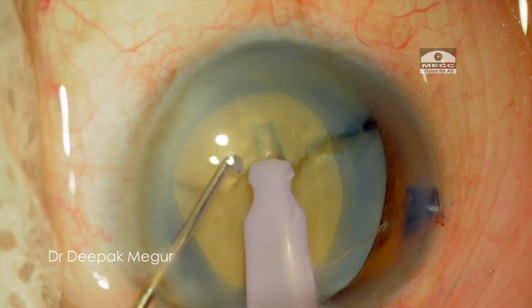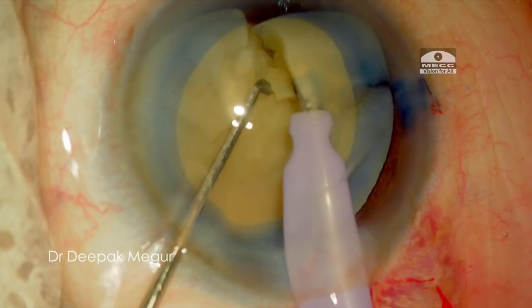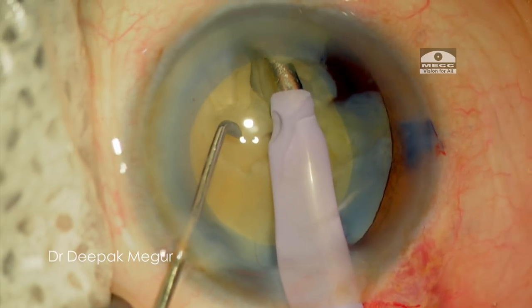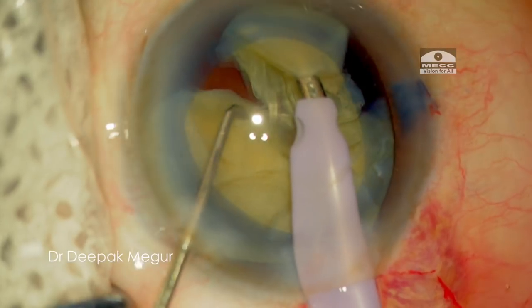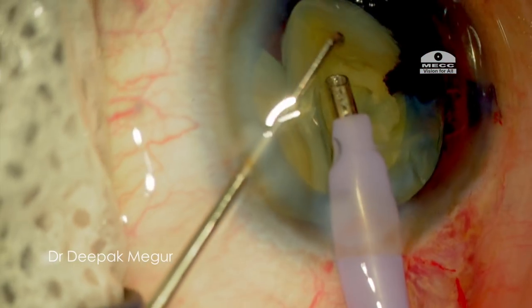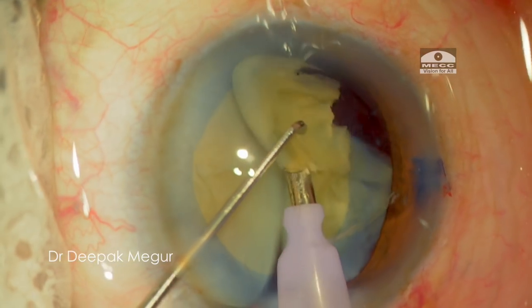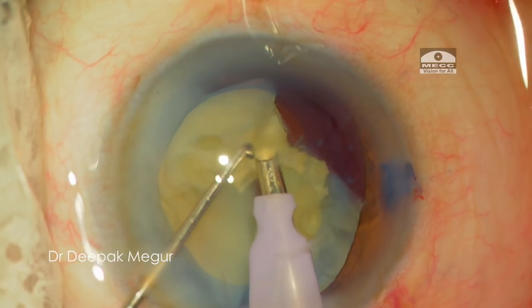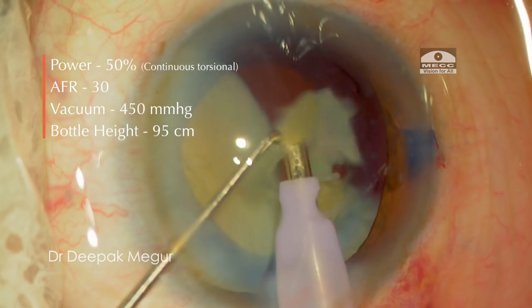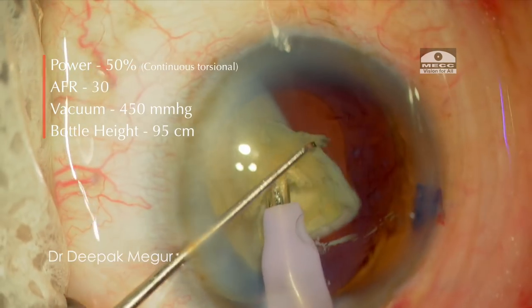Moving on to the next chop: after burying my tip, again I lift up the nucleus and see that it is just touching the anterior capsule, then my chopper goes down vertically and then laterally. It is to be noted that my right hand with the phaco probe is held still and almost all of the manoeuvres are being done primarily with my left hand only. We can see that a small band of nuclear tissue is just holding the posterior plate of the two fragments together. The fragments are turned up and then easily released by phacoing, and the fragment is consumed at the iris plane. The second fragment is then consumed similarly, ensuring that there is minimal turbulence and chatter.